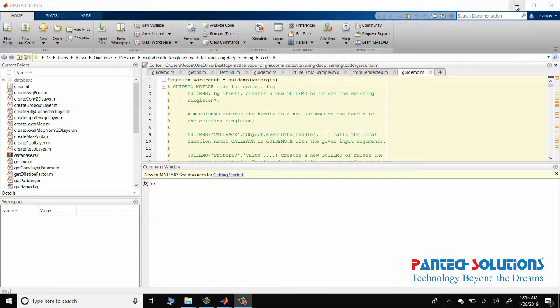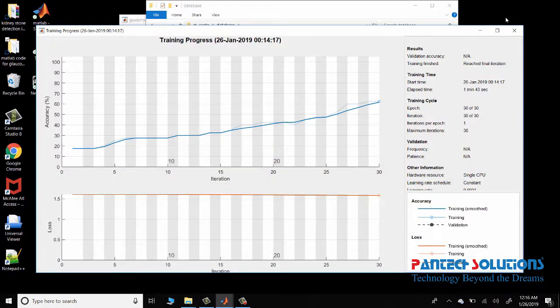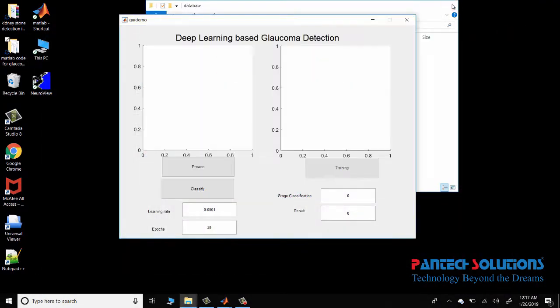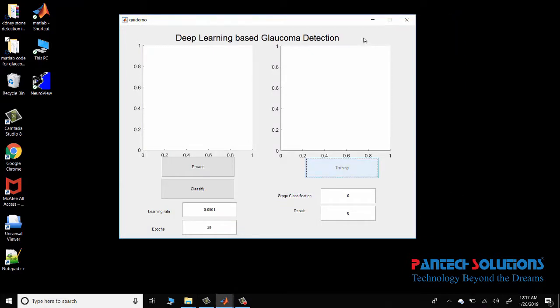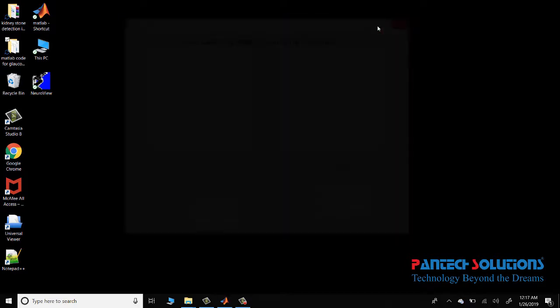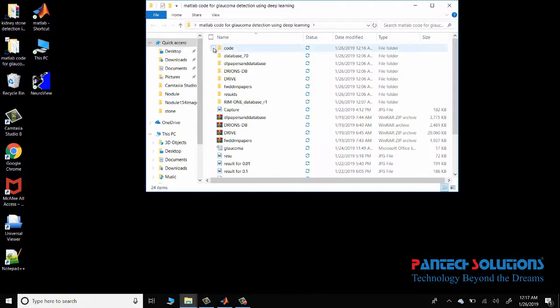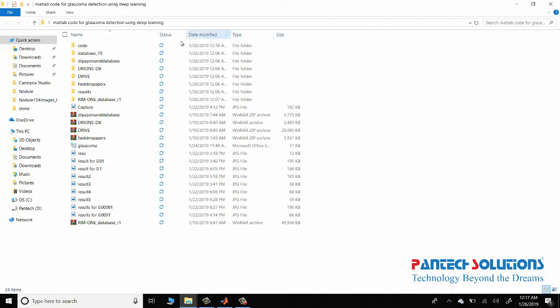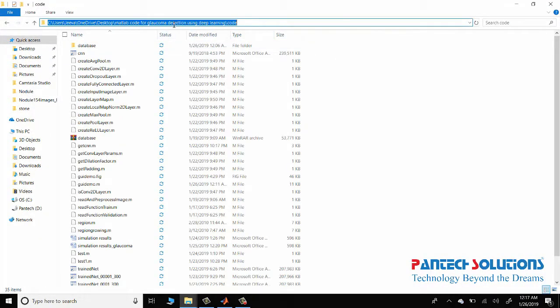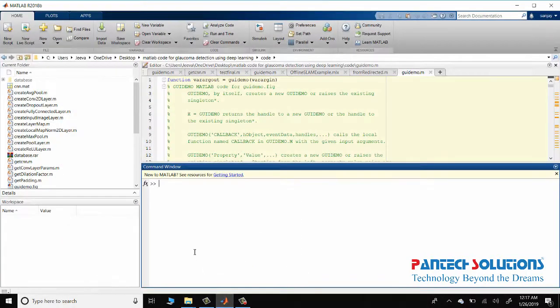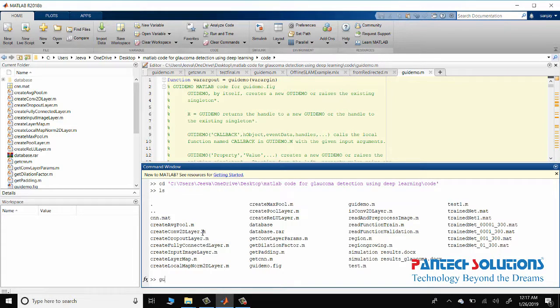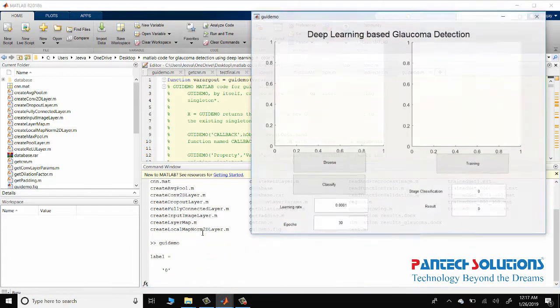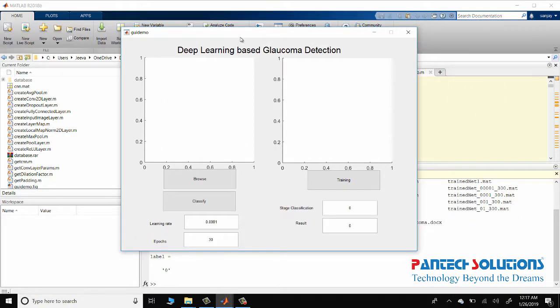Welcome to Pantac Solutions. In this video, we are going to have a demo on glaucoma detection using MATLAB. We have used a deep learning based approach, so I'm going to open this folder, copy the path, change this path. This will open the GUI.